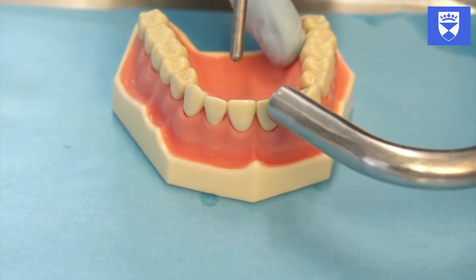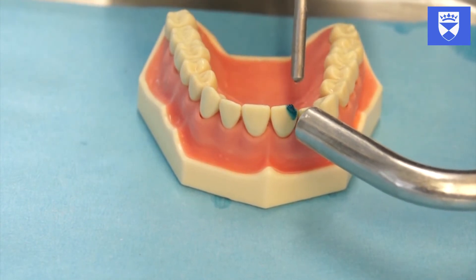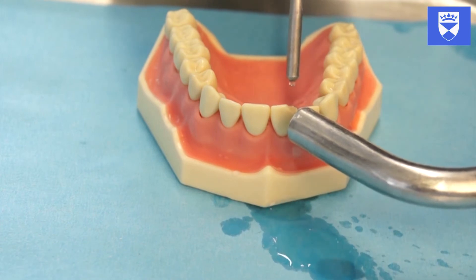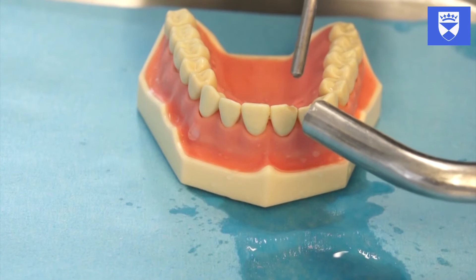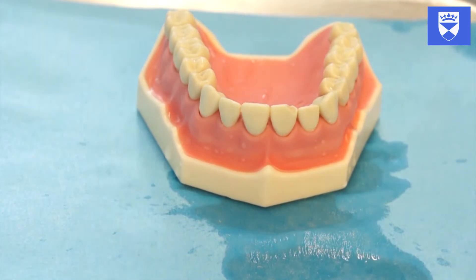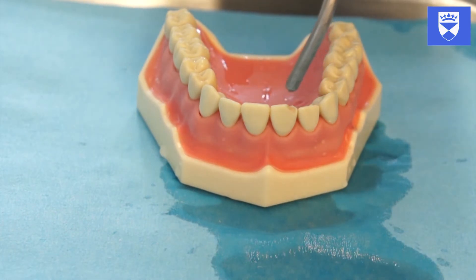Thoroughly rinse off the etch for 15 to 20 seconds. Dry the tooth and observe frosting.